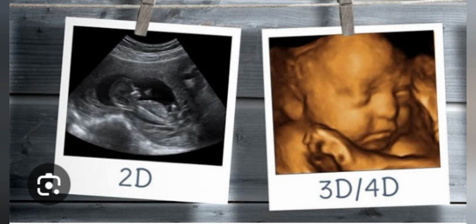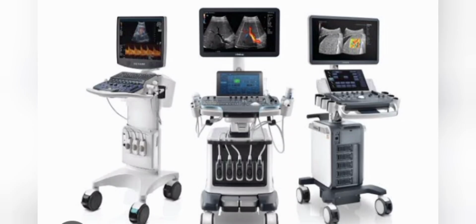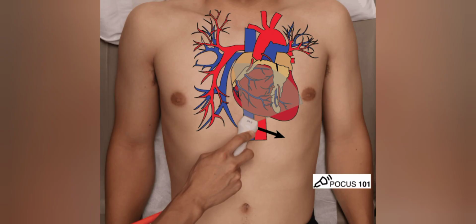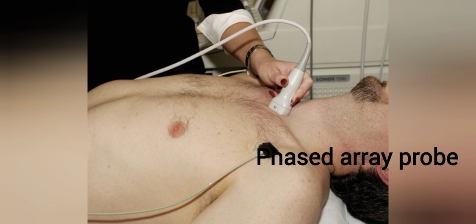Now, as there are types of probes, there are different types of ultrasound machines also. According to their specialties, one by one we will see them. The first type is cardiac ultrasound. These machines are specialized for examination of heart and heart vessels respectively. Cardiac ultrasound, also known as echocardiogram, examines size, shape and motion of heart. Dedicated cardiac machines come with specialized systems and software that ease cardiac examination and give better data analysis. For cardiac machine, phased array probe is used.